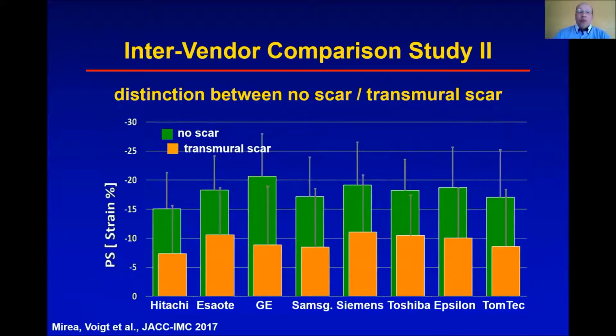What is also important is that the software which you use for speckle tracking strain doesn't smooth too much over the area. If you want to go regional, you really want to detect local changes in myocardial function. So if you have a small scar, your software should show a small strain at that point, but in the neighbor regions, the strain should be high and normal. So what we also tried, our patients all had infarct scars, and all these infarct scars were characterized by MRI delayed enhancement, so we knew exactly where they were.